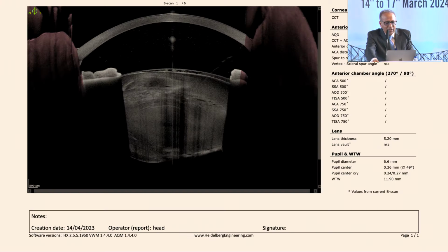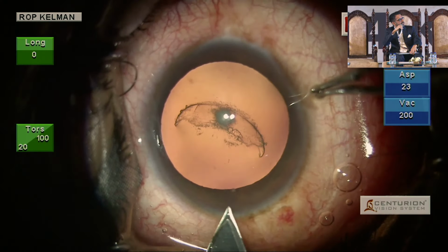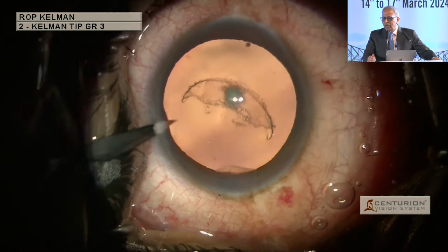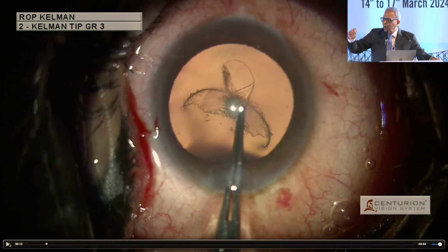So this has already been taken up. What are the chances of an anterior capsular tear in a fibrotic cataract? It is definitely less as compared to an intumescent cataract or other cataracts, because the fibrotic sheet doesn't easily extend and become a wraparound tear.